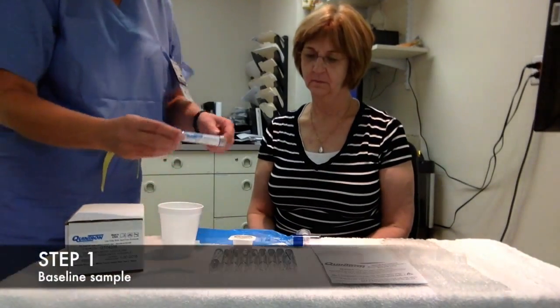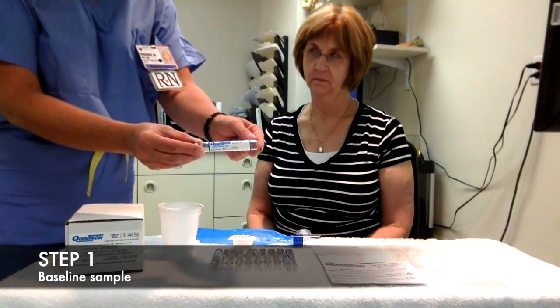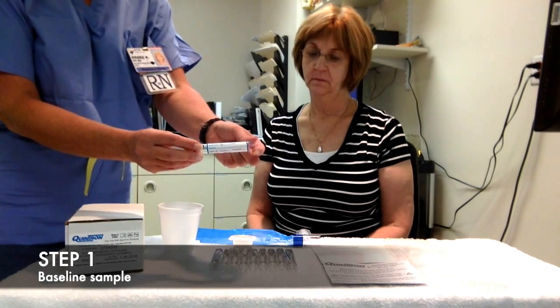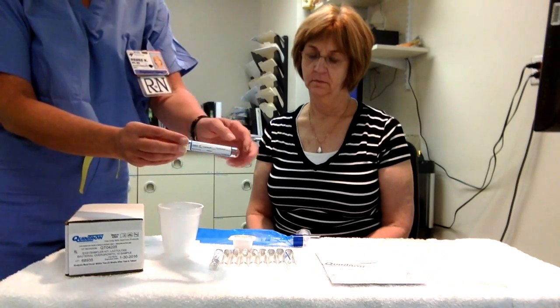We will demonstrate how to get a sample. Right now, we've labeled the first one with the number one at the top for baseline. We put our time and our date and also marked which test, and of course you'll fill out your name also on there.